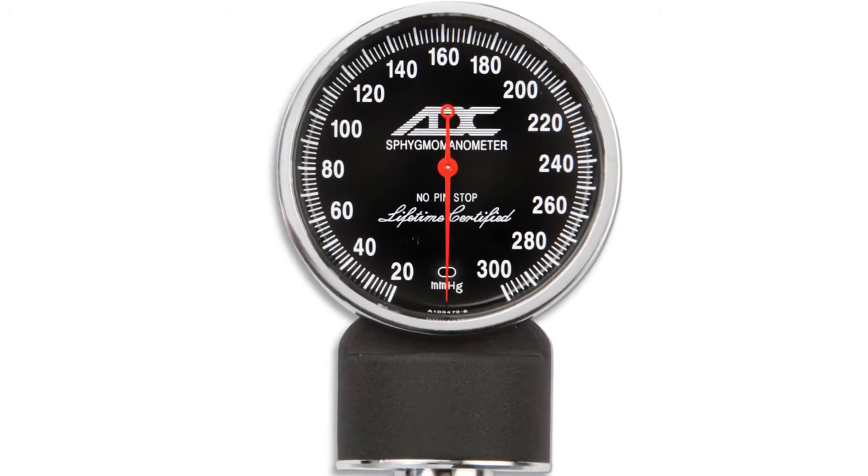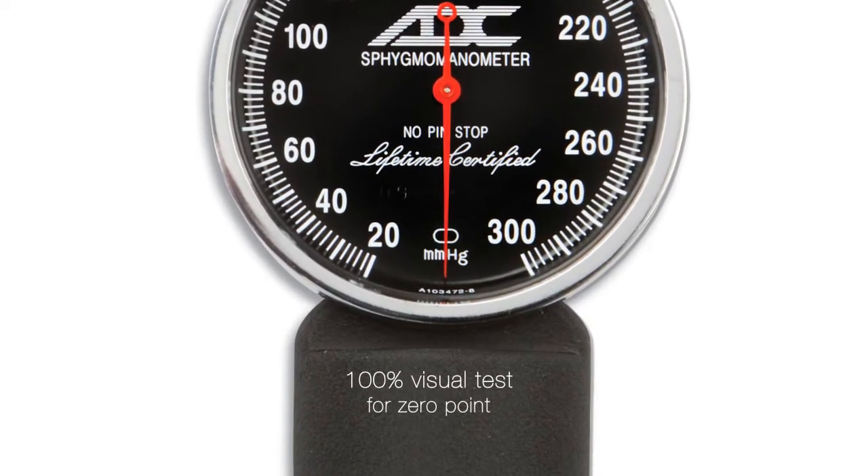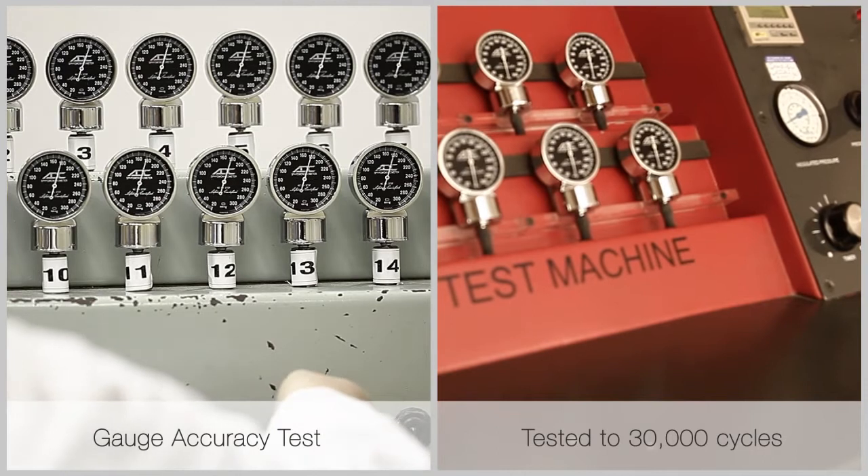ADC conducts three different tests at our New York facility to ensure strict compliance, not just with industry standards, but our own more rigorous requirements.